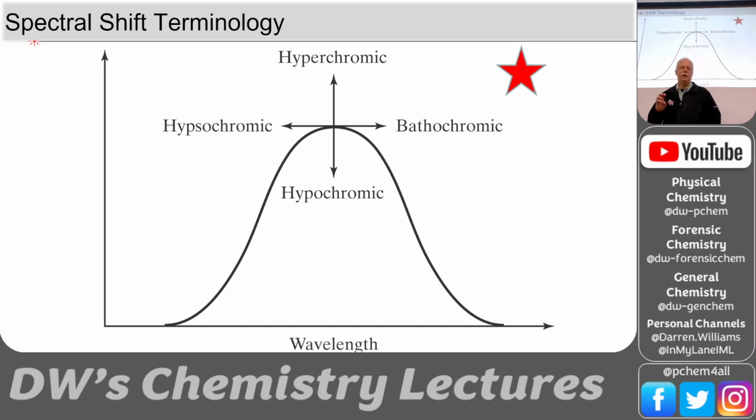Now, these are some new vocabulary words for you in terms of the appearance of color. So it's related to the peaks that absorb the visible light, and when they shift, they give a bathochromic shift, a hypsochromic shift, a hyperchromic shift, or a hypochromic shift. So chromic is used in all of these, and we're not talking about chromium, we're talking about color. So what do you think hypercolor means? It gets more vivid, stronger colored, and hypo means less colored.